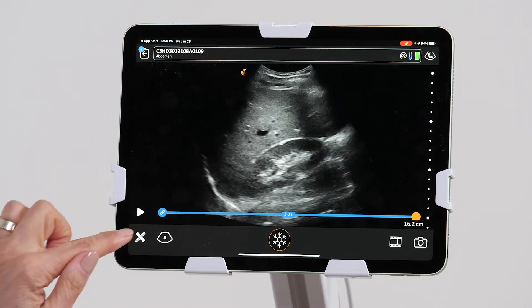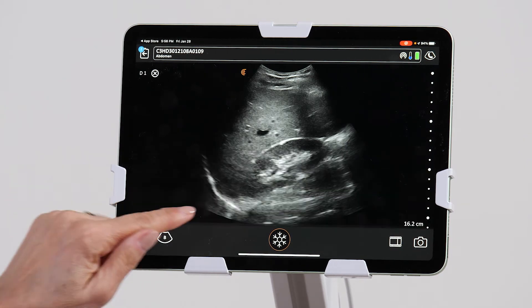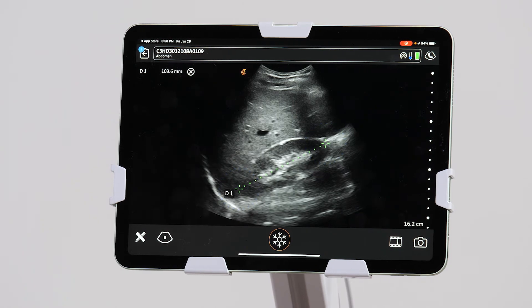To perform measurements, I just click on the measurement icon, select a distance measurement, and tap on either end of the structure that I want to measure, and then take an image.